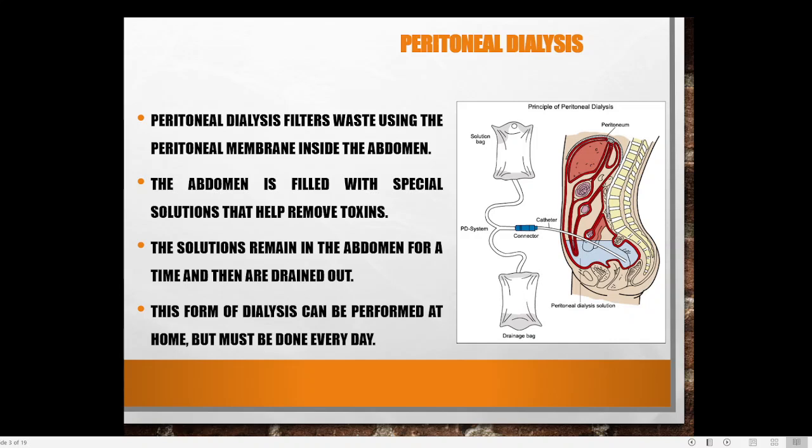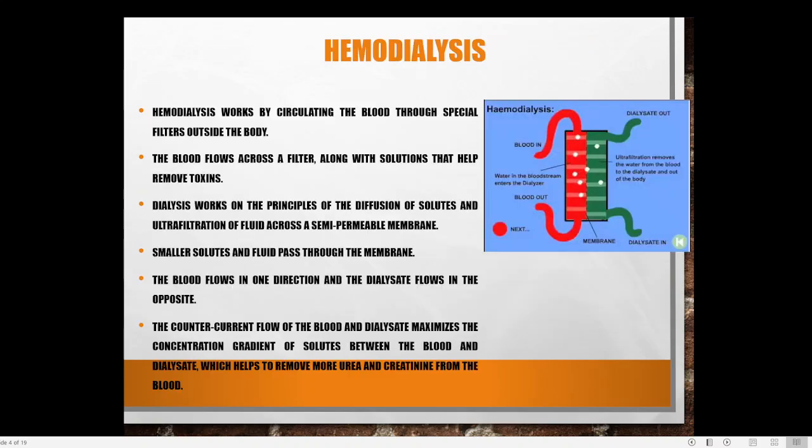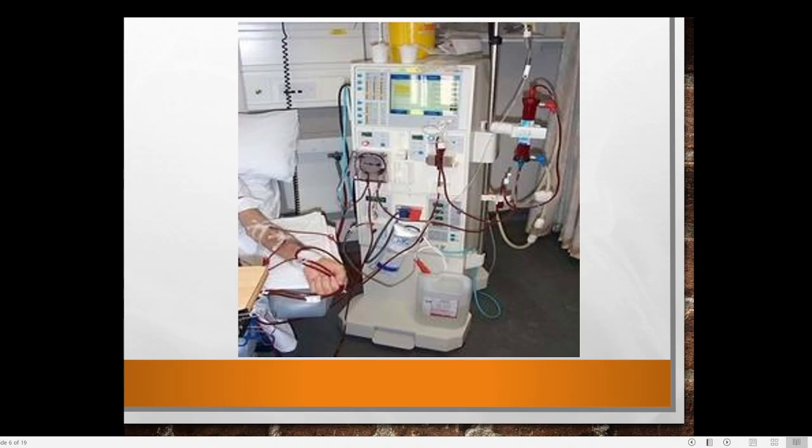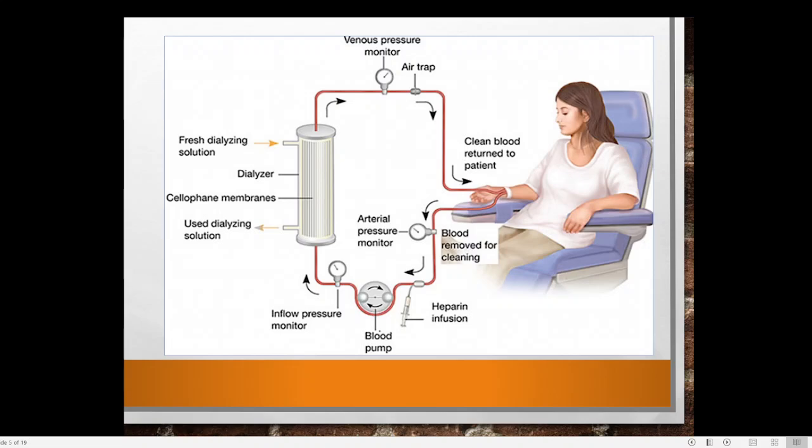This is regarding the second type known by the name haemodialysis. The first one is using the abdominal cavity or peritoneal cavity. That is why we are calling it peritoneal dialysis. And the second will be using the blood more. That is why we call it by the name haemodialysis. Here also you can see another picture of that. So for example, if you keep drawing this picture, that will help you to get a good idea of how a dialyzing machine is working.